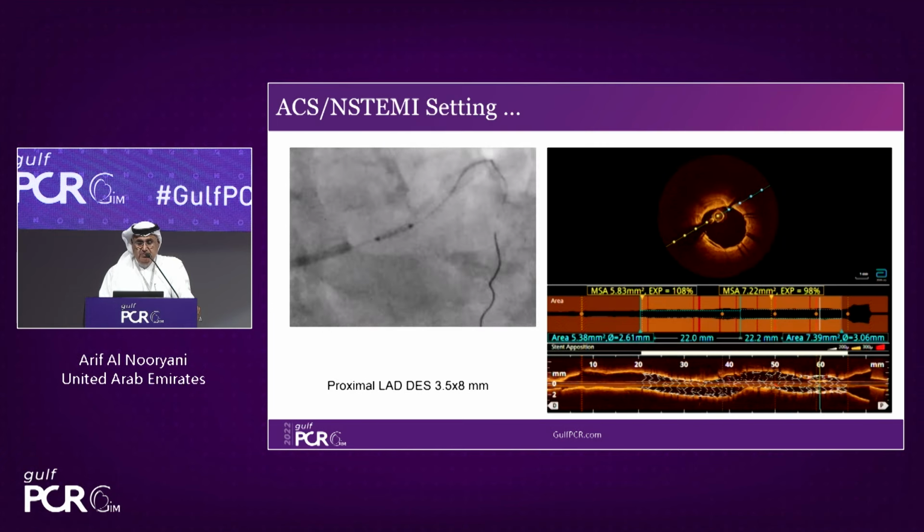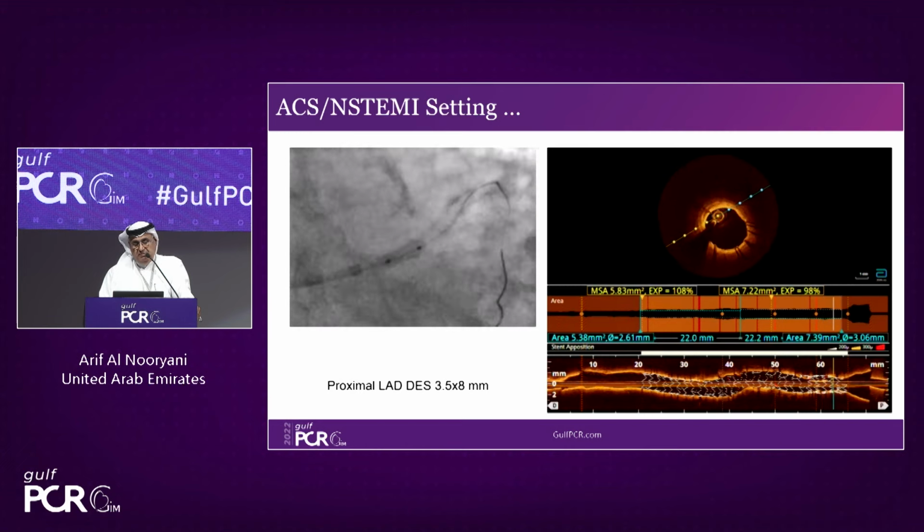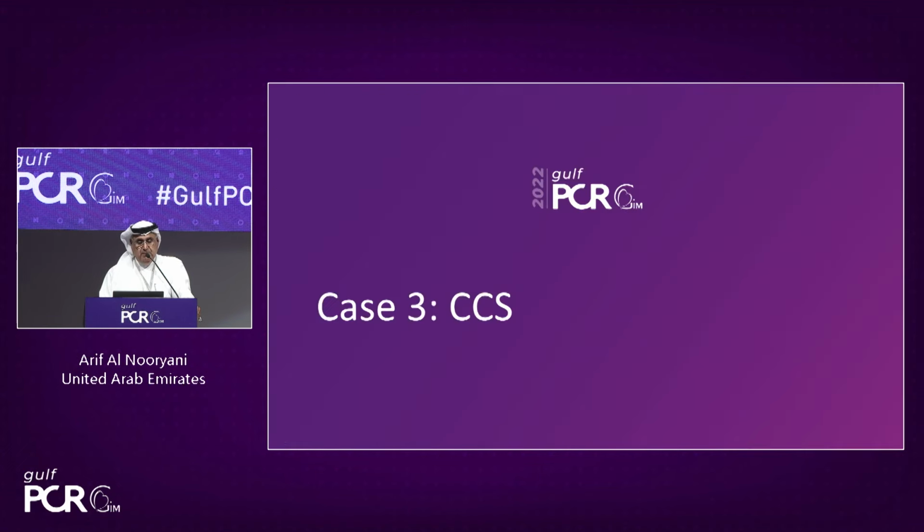And this is the beauty again. That couldn't have been detected otherwise.